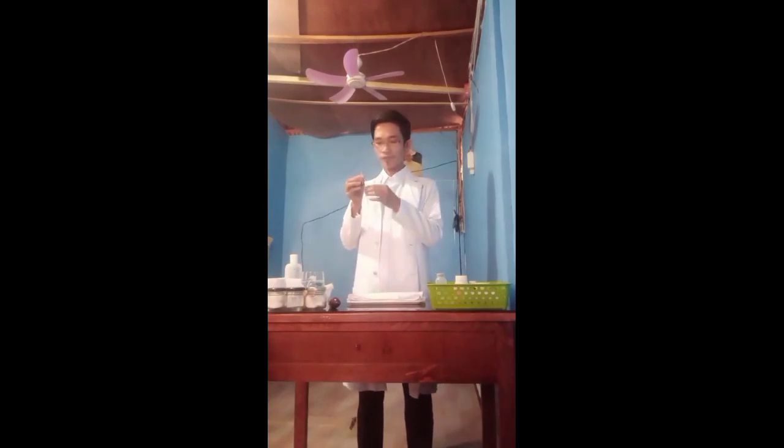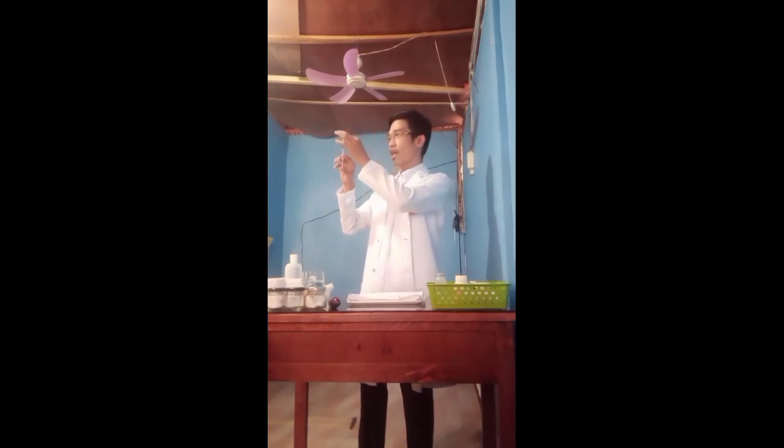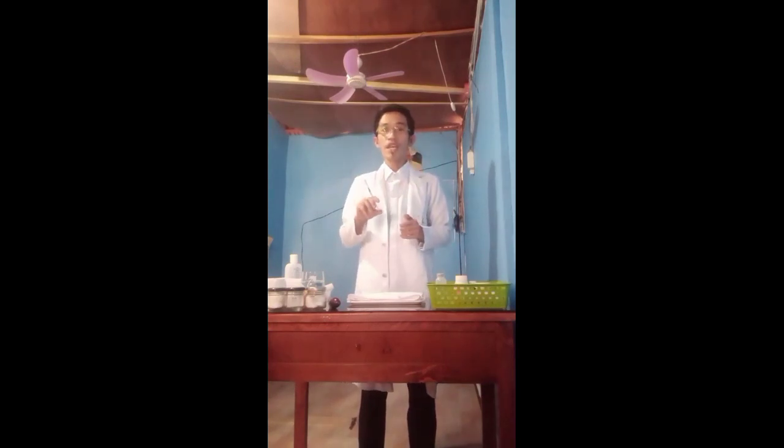If you see any air bubble inside the syringe, you just need to let it out. Okay, so good now. This is to prevent any medication error and to avoid bending the needle.